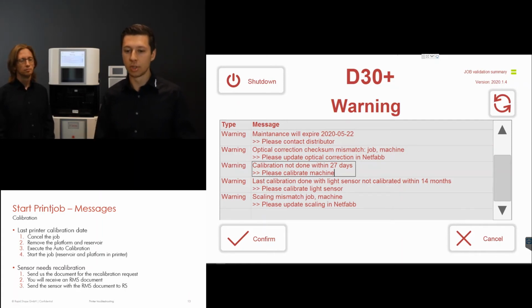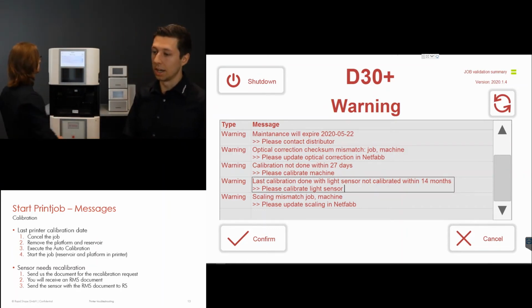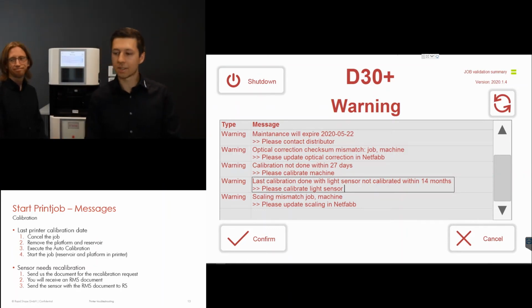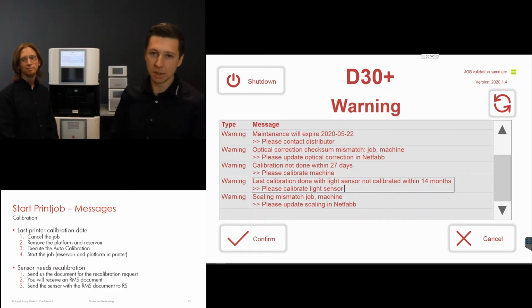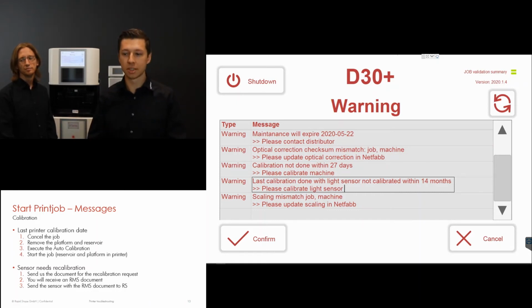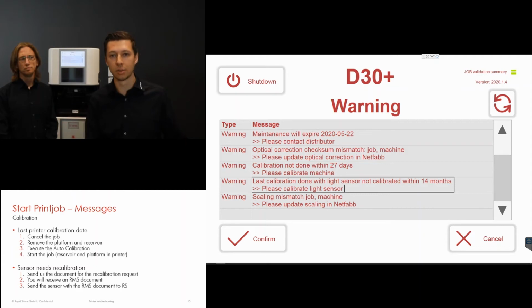Sensor needs recalibration. Where to find it, or is it somewhere hidden? There it is. Last calibration done with the light sensor not calibrated within 14 months. It's a little bit confusing, but this information just tells us that the last calibration we have done on the machine was done with a sensor, but the sensor is now outdated. Within 14 months means 2 months over the yearly calibration.